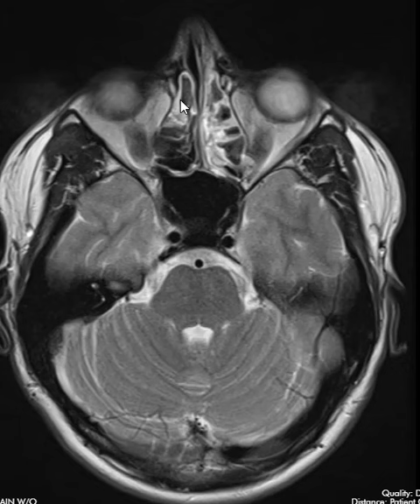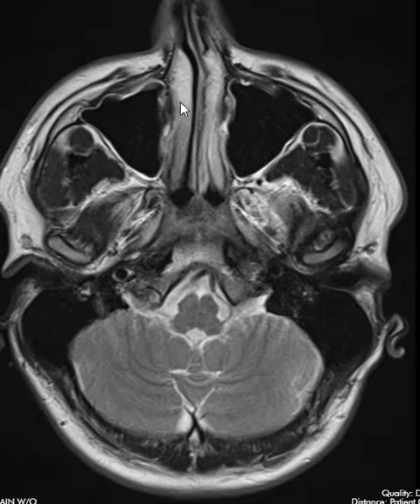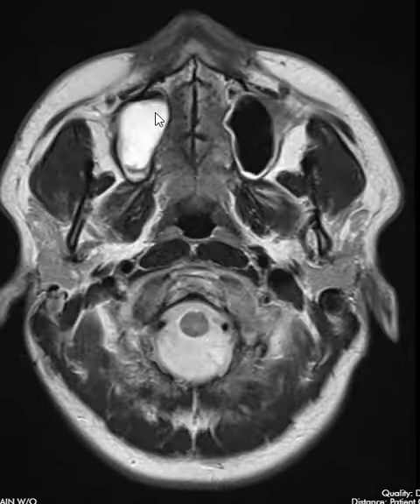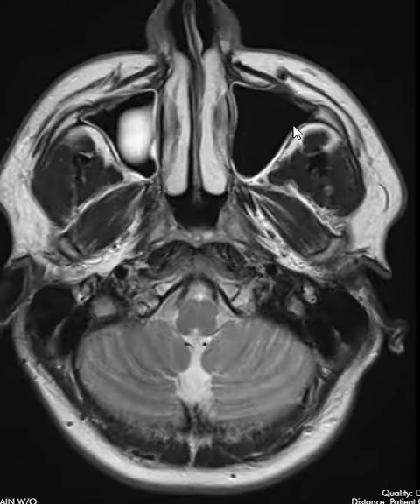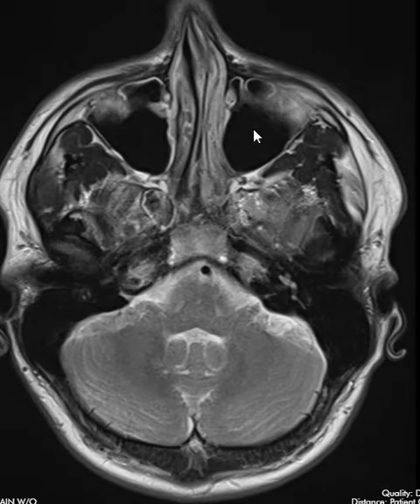Here's the right ethmoid sinus with mucosal thickening. We come down here to the right maxillary sinus, and we see this round area that's really white. This is what we call a retention cyst — it's a cyst in the right maxillary sinus. The left maxillary sinus had this little rim of brightness, a little bit of mucosal thickening.